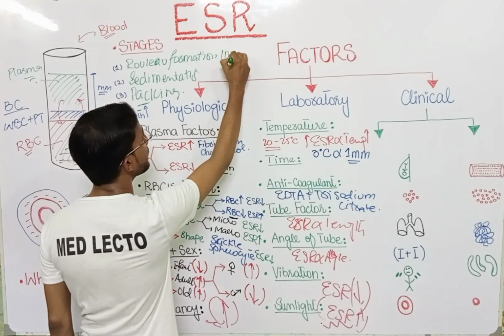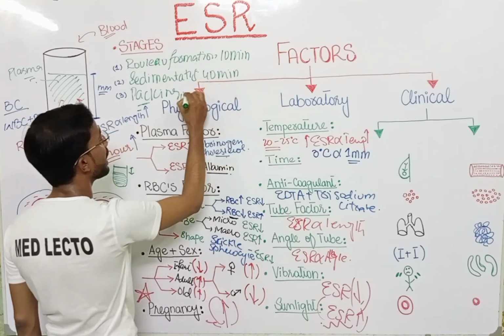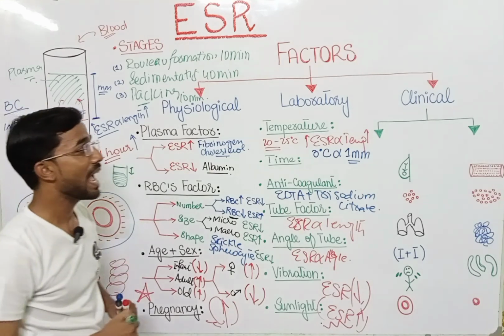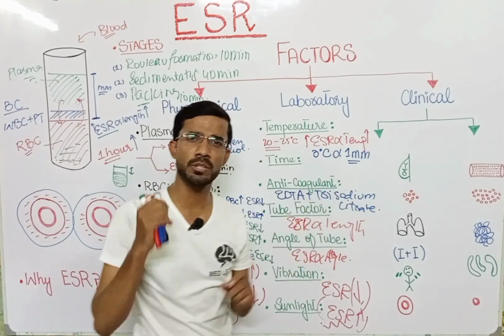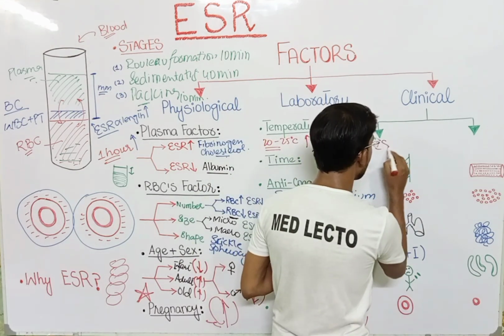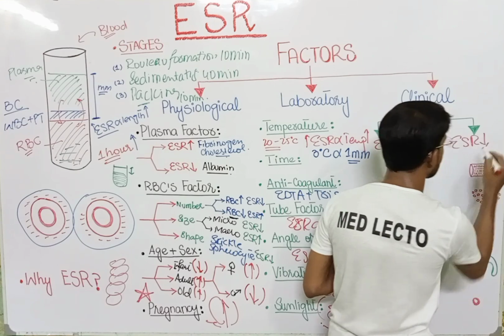Okay, that will take 10 minutes, that will take 40, and packing will also take 10 minutes. The total will be 1 hour. Okay, next, if we see the clinical, this is most important. In what situation do we see an increase in ESR, and in what situation do we see a decrease in ESR?